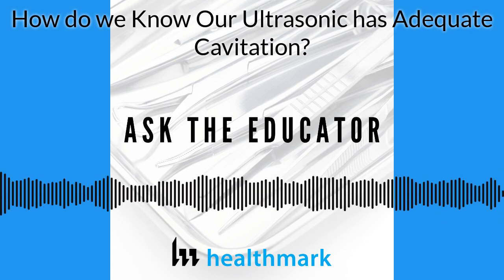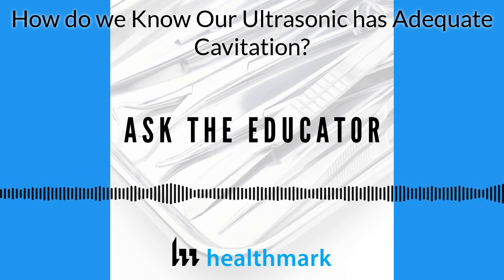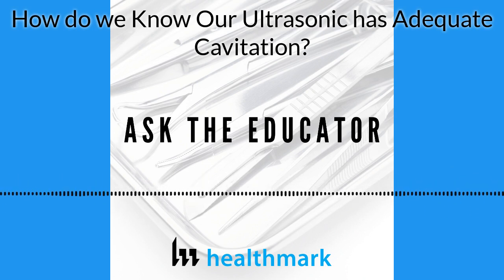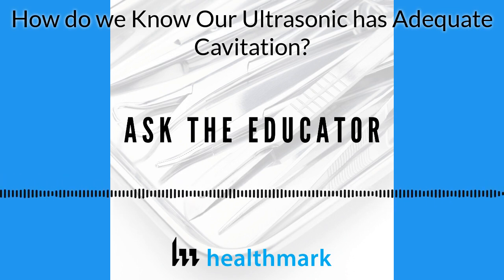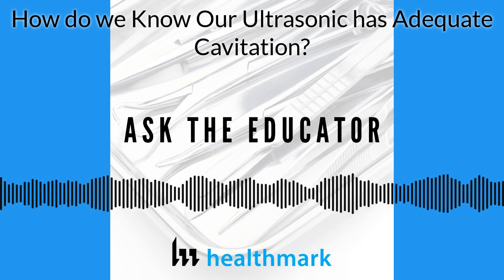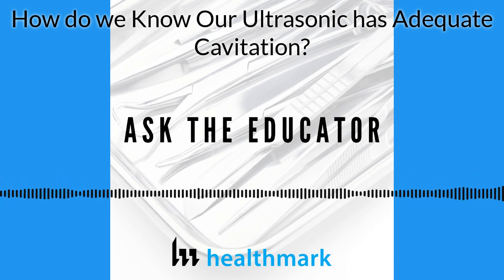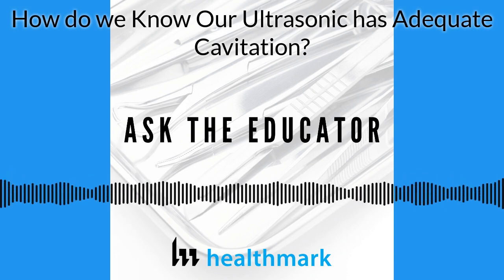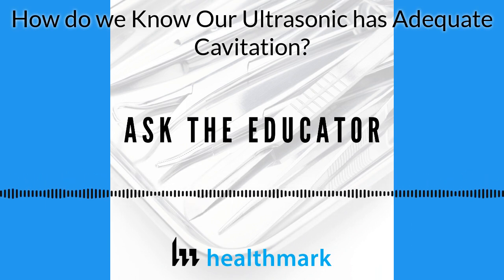All right, let's recap the show. Cavitation. It's the vacuum or suction-like force that is produced in your ultrasonic bath by the transducers. This is what helps clean inside all the nooks and crannies of your medical devices. Remember, Amy recommends the testing of all 3 ultrasonic functions: cleaning, inside the lumens or flushing, and cavitation, all a part of your quality management system.